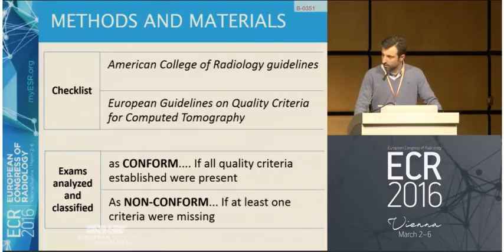The checklist was according to the American College of Radiology guidelines and the European guidelines on quality criteria for computed tomography. We considered the exams analyzed and classified, and this part is very important because we established strict criteria: conform if all quality criteria established were present, non-conform if at least one criterion was missing.